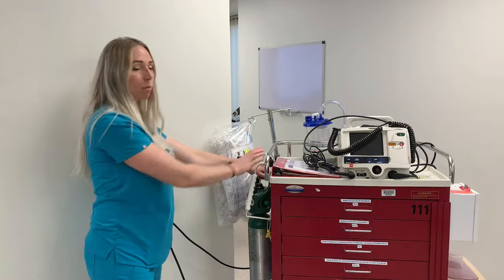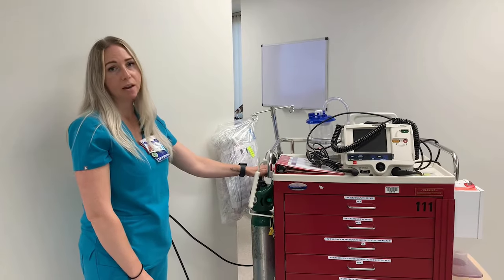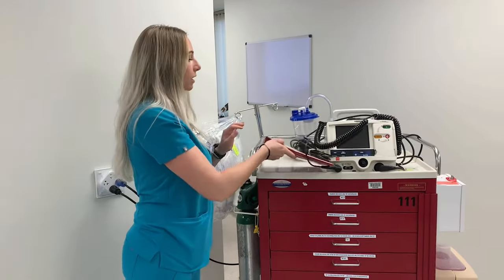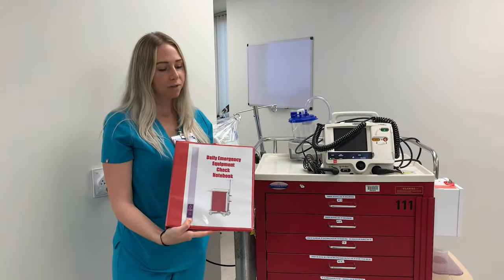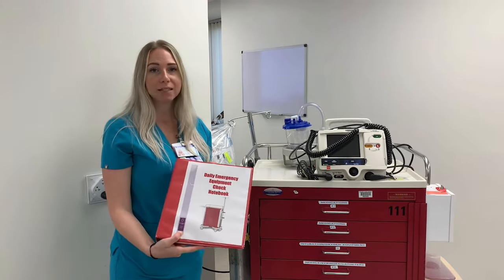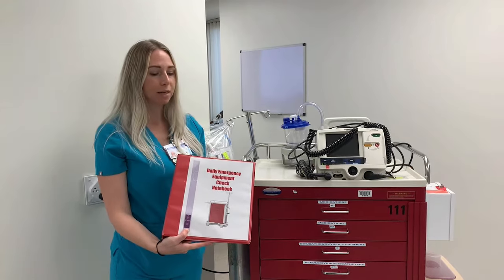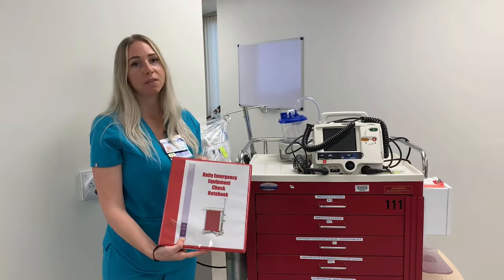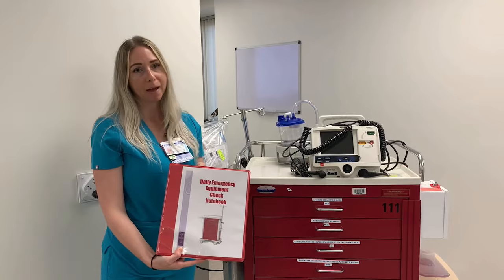That oxygen canister is very important to make sure that it's full, and that's one of the checks that needs to be done daily when the code cart is being checked. Finally we have our red binder. This red binder sits on the top of all of the crash carts. This is going to have your documentation, so if you have a code blue you'll document on the sheet provided. It also contains checklists that need to be completed every 24 hours to make sure that the cart is in working order, and it will also contain an extra pair of defibrillation pads that you can access very easily when you enter the patient's room.